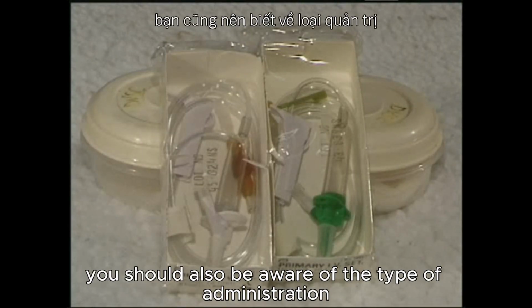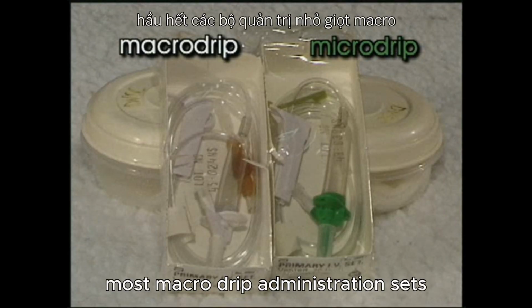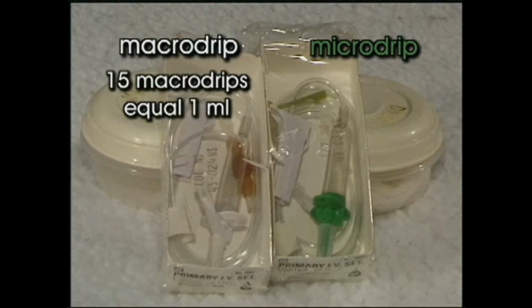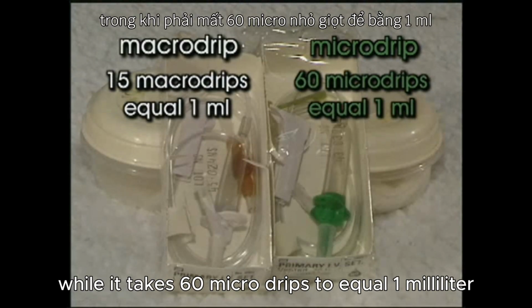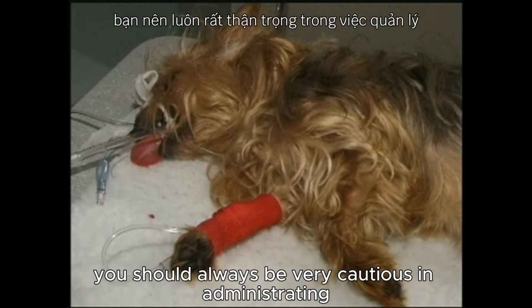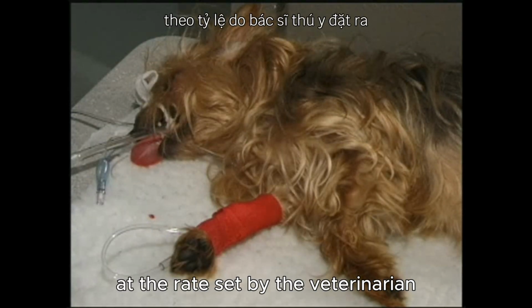You should also be aware of the type of administration set being used. Most macro drip administration sets produce a large fluid drop, while the micro drip sets produce a small drop. 15 macro drips equal 1 milliliter of fluid, while it takes 60 micro drips to equal 1 milliliter. Regardless of the fluid administration equipment you're using, you should always be very cautious in administering only the amount of fluid prescribed at the rate set by the veterinarian.